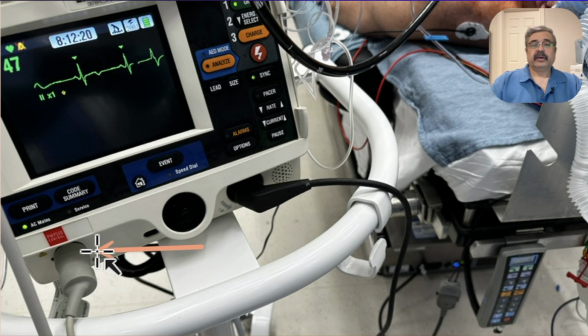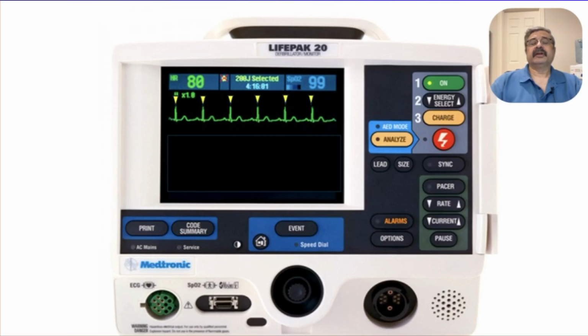So when the patient is ready for synchronized cardioversion, this is exactly what the display should look like, which is a very safe and optimal position. It means the patient is connected, the monitor is turned on, the EKG signal is being captured, and you have pressed the sync button so that you can safely cardiovert the patient by preventing an R-on-T phenomenon.